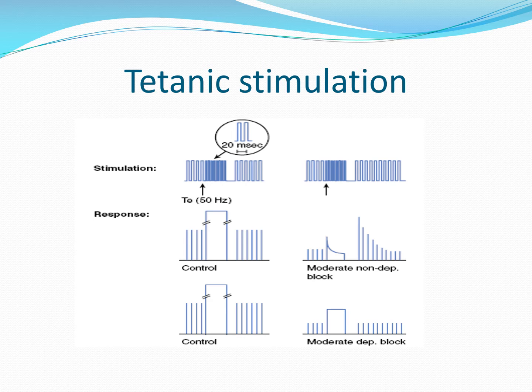Here the tetanic stimulation at 50 Hz, and we note the difference in the response between the non-depolarizing blockade and depolarizing blockade. In non-depolarizing blockade, there is fade in the response, tetanic fade. And when we give another single twitch after this tetany, we note improvement, increase in the amplitude of the single twitch. Then it begins to go back again to its low level, and this is called post-tetanic facilitation.